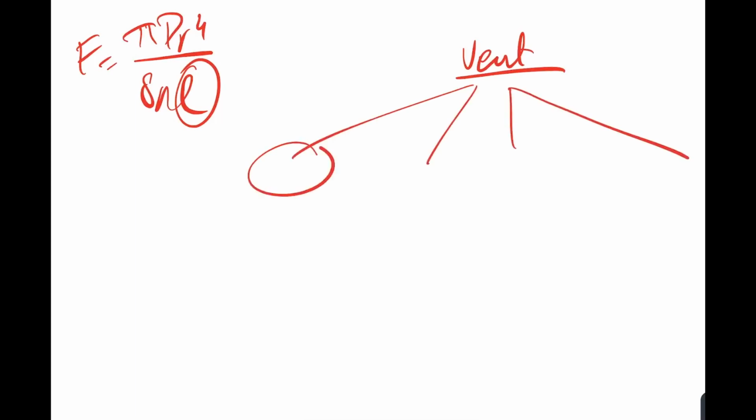One last thing before I end this video. So the flow equation tells us that the flow of any fluid is dependent on multiple factors. The one that we care about in this case is the length of the tubing. So if we have a ventilator and we attach it to 4 patients, we will see that the patients over here and here on each end have a longer length of tube, which means they have a decreased flow.